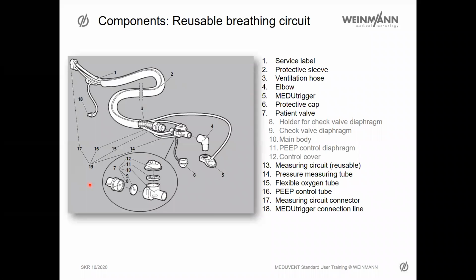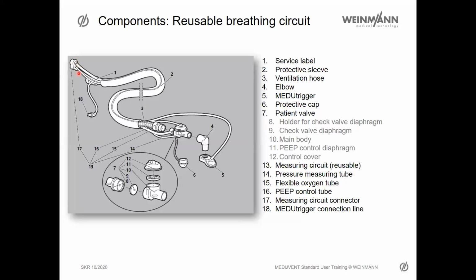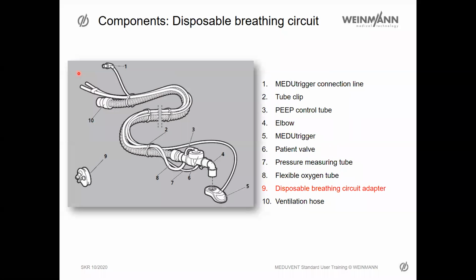So as you see here at the reusable breathing circuit, we have a fixed adapter right here, where the hoses get into, and at the disposable breathing circuit, we have hoses which are free, so they will be put in this disposable breathing circuit adapter, which is fixed mounted on the MEDUVENT standard.